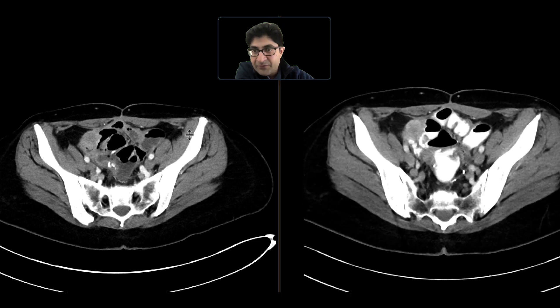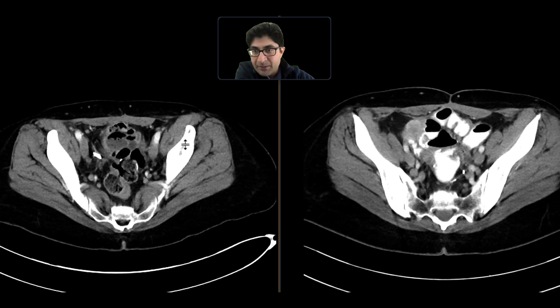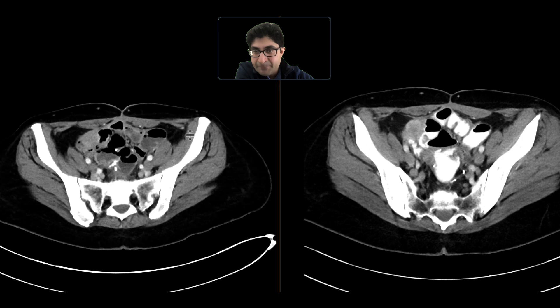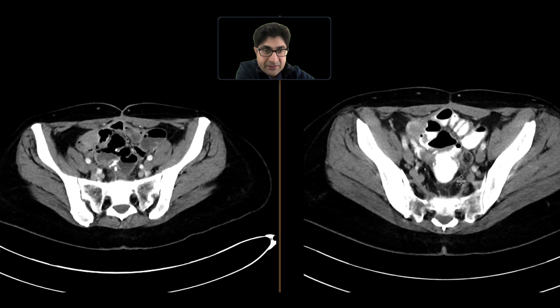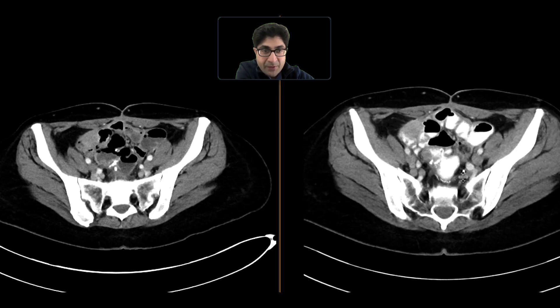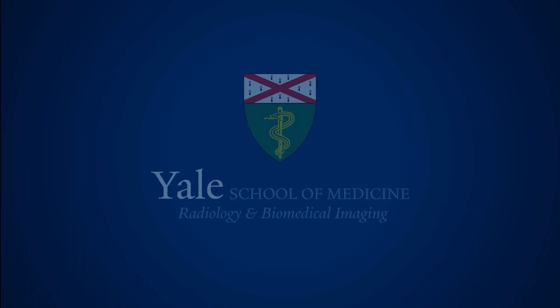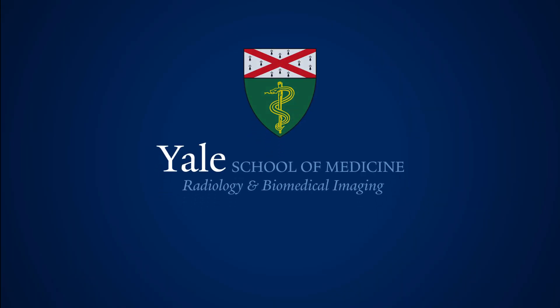Luckily, in this case we were able to pick up this finding on the first CT, and it was stable on the next CT. These findings are compatible with recurrent neoplasm.